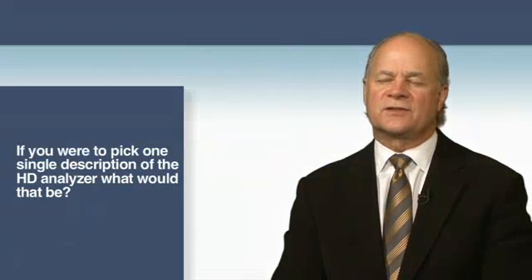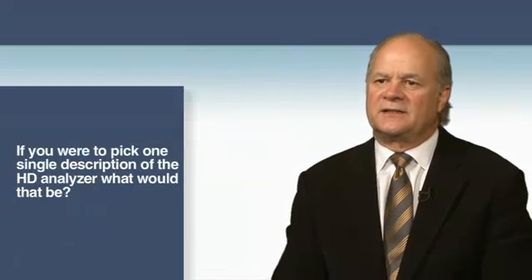One of the things that's starting to float around amongst my colleagues, and the HD Analyzer is really driving this, is ocular scatter. We've never talked about it before because we couldn't measure it. We kind of knew that light gets scattered from your tear film and your cornea and your lens. But now we've got a new term, the objective scatter index, OSI, a measurement that comes out of the machine.